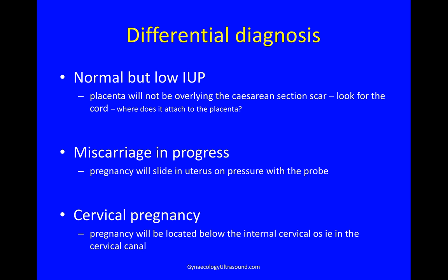The differential diagnosis of a caesarean scar pregnancy is a normal but low-lying intrauterine pregnancy — in this case the placenta will not be overlying the caesarean section scar, so look for the cord: where does it attach to the placenta, and where is the placenta attached to the uterus? Another possibility is a miscarriage in progress — in this case the pregnancy will slide in the uterus on pressure with the probe and not be implanted low. Or a cervical pregnancy, where the pregnancy will be located below the internal cervical os, that is in the cervical canal.